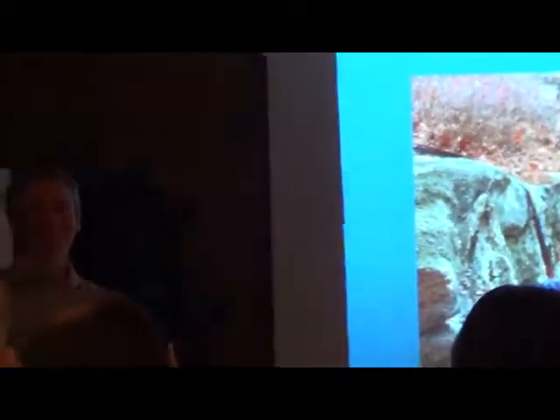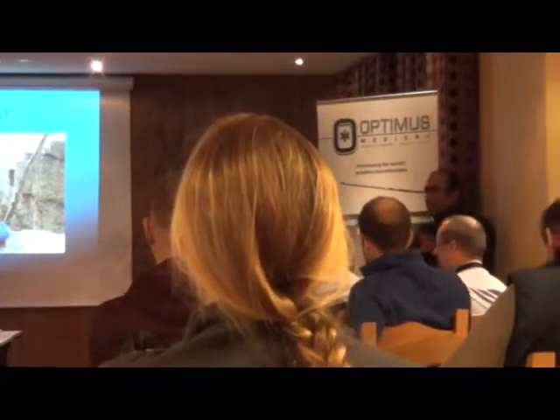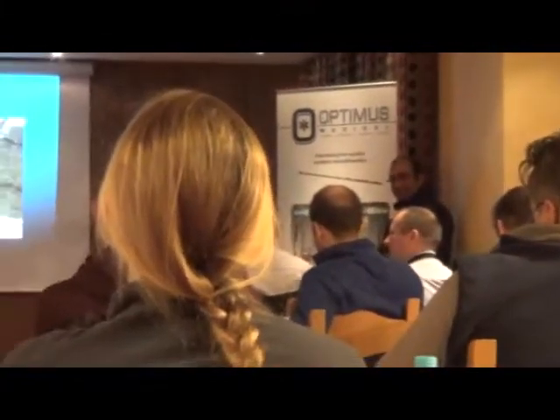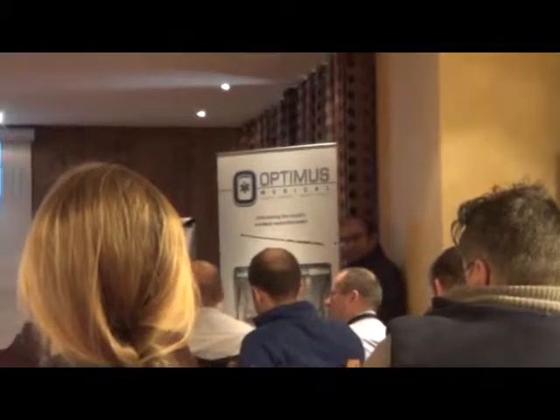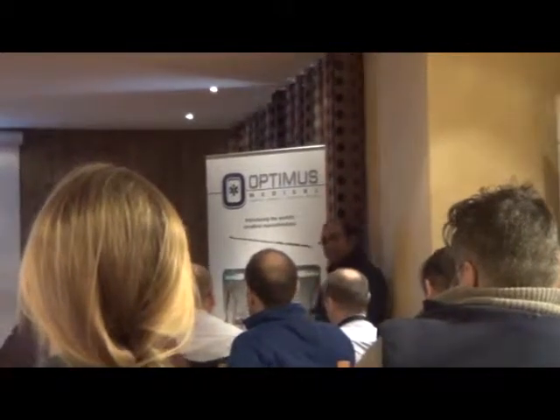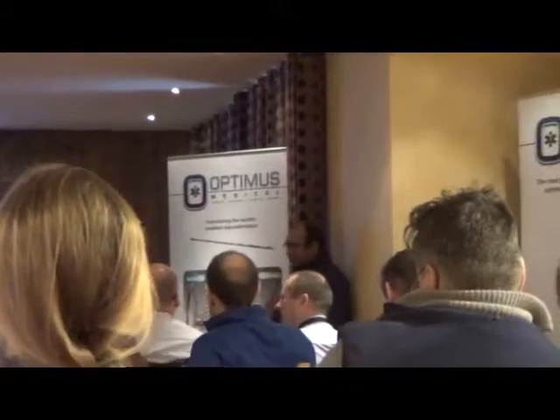So why don't we just do a cervical epidural, which is inherently safer than a transforaminal? It's just for argument's sake, not questioning. During my talk I was pointing out that with the extraforaminal approach you don't stick your needle into the foramen, and you may have a similar response, and so you save that. True. We call it extraforaminal, not transforaminal. Okay, fine. That's better.